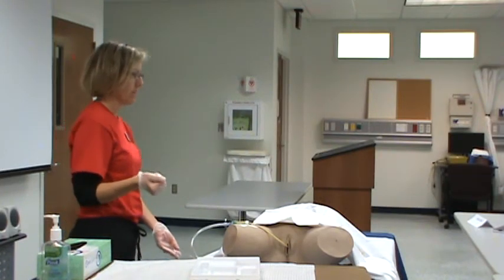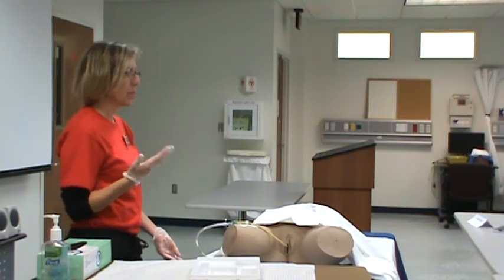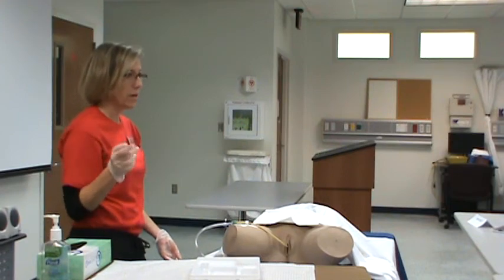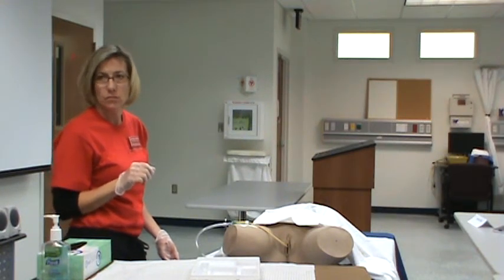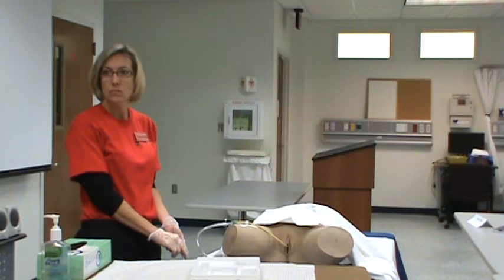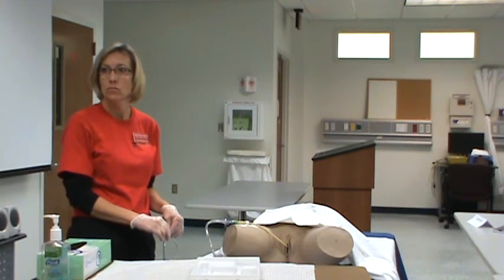Questions about female catheterization? Why don't you pre-inflate anymore? The evidence doesn't support the pre-inflation. We used to do it to check for holes. And I think in my whole entire career, I had one with a little pin leak. The other thing the evidence says is that the pre-inflation causes little ripples in the catheter tip, and then it's causing urethral trauma as it's going in and irritating that area. And manufacturers will essentially QC and test their devices so we no longer need the pre-inflation. So you'll know if you have a defective catheter because it won't stay.